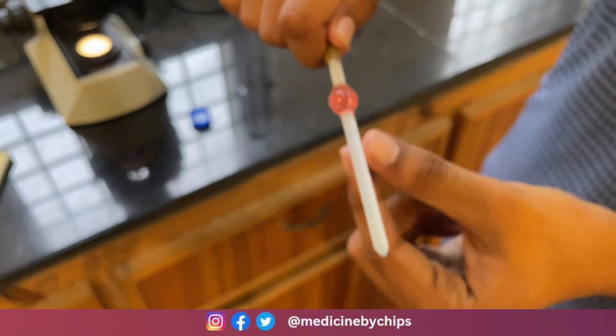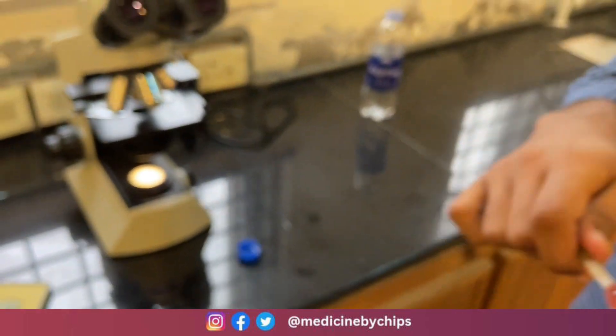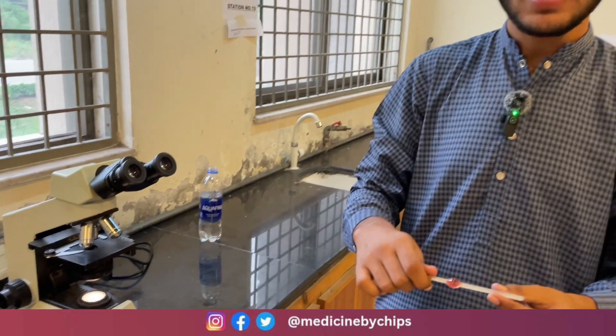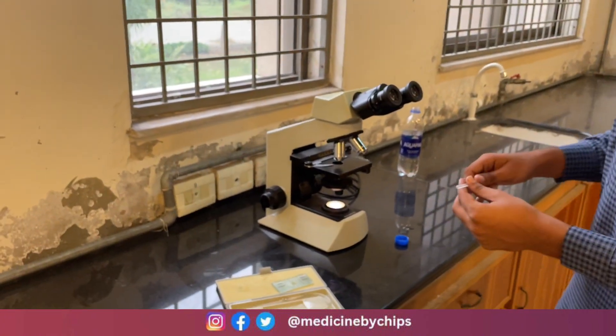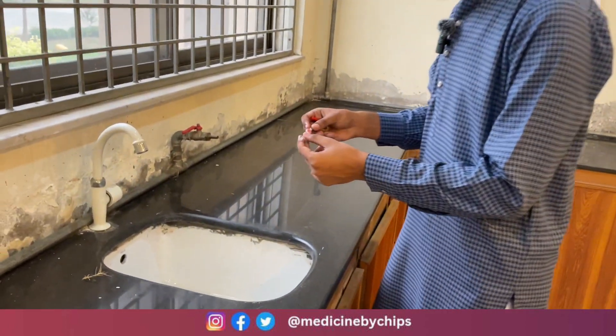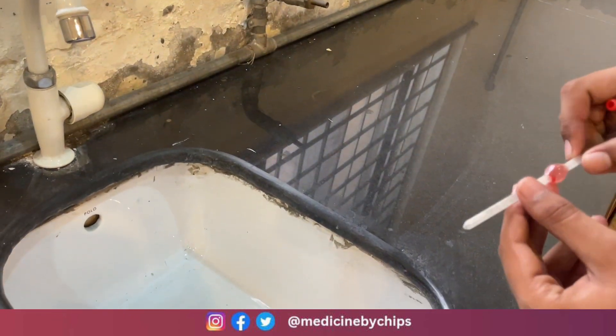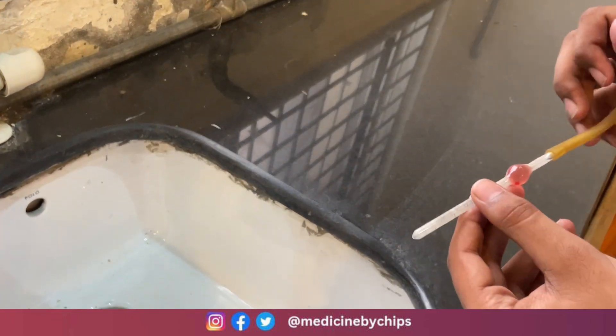If you are using Hayem's fluid, then wait for 3 to 4 minutes. Since we are using saline solution, we will wait for one hour. After one hour we are back and continuing the experiment. We will discard the first few drops of the solution.